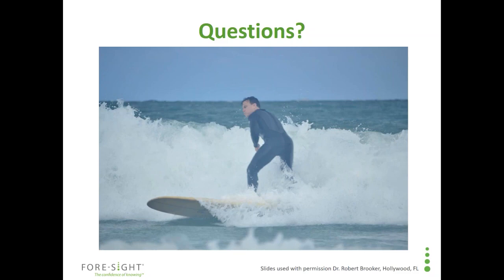Well, as I mentioned in the presentation, for our routine cardiac surgical cases, every case gets a TEE, so echocardiography intraoperatively. Every case gets epiaortic scanning. Every case has cerebral oximetry monitoring. Now, that's for routine cardiac cases. If we're going to do complex aortic work, or there is a chance for circulatory arrest, then we will add 16-channel EEG monitoring to that. So that's our current array of things we will use, and expanding the monitoring to include the EEG really hinges on whether we think we're going to do a circulatory arrest.